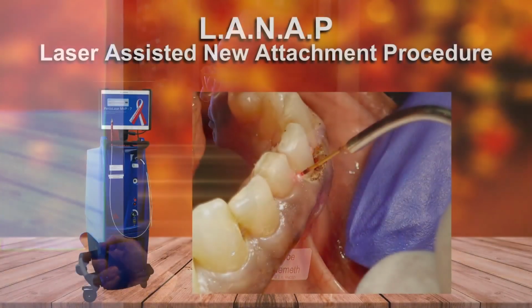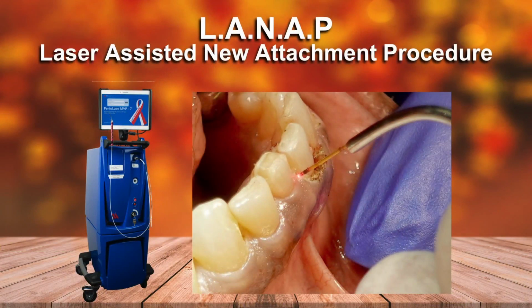Because each laser does something different. So each laser has its frequency and is beneficial for different procedures. So mostly I use the Millennium or LANAP laser. I love it. You know, it's great.